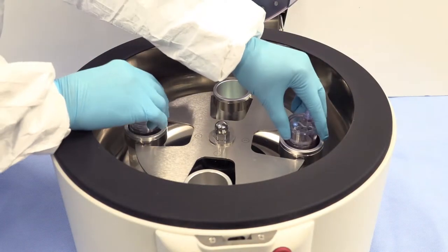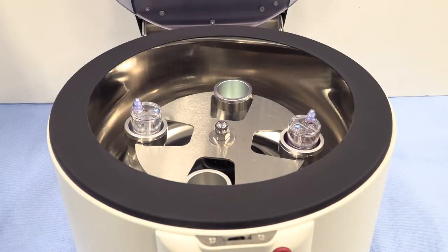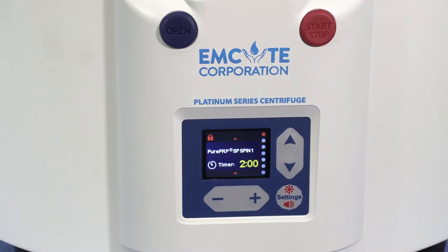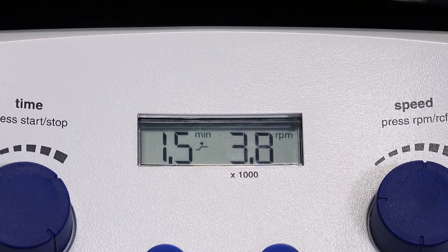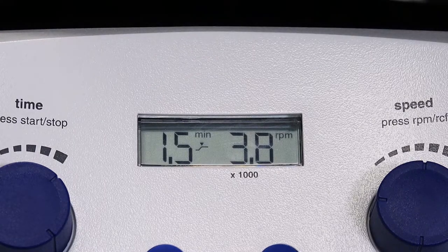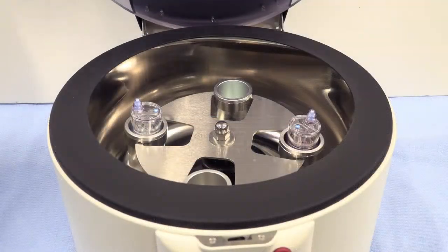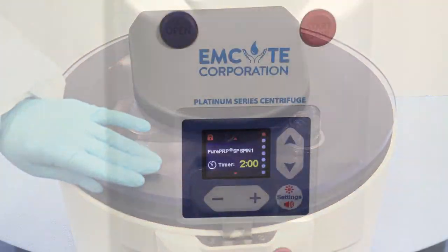Place both devices in the centrifuge rotor at opposite ends. Set the Platinum Series centrifuge at Pure PRP SP SPIN 1, or set the Executive Series centrifuge at 1.5 minutes at 3800 RPMs. Close the centrifuge lid and press Start.